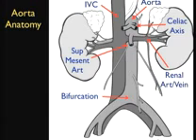We see here that the renal arteries come off just at about the level of the mesenteric artery. Thus, we need to pay particular attention to this portion of the aorta, as this is where the majority of aneurysms will be located.